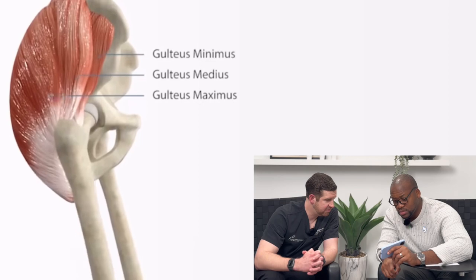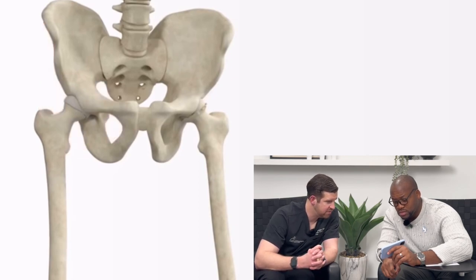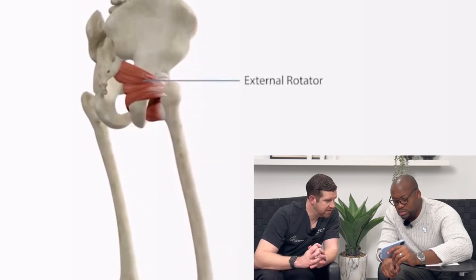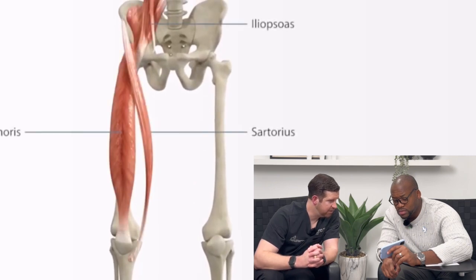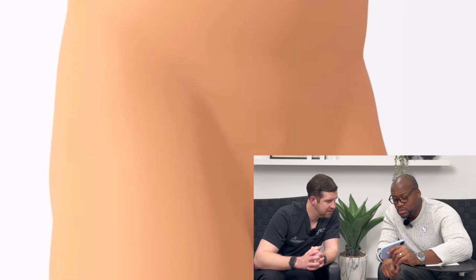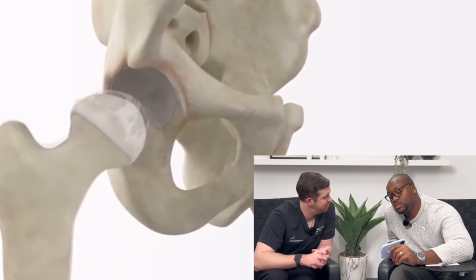You make an incision on the skin — this is showing those muscle planes and how you get to the joint. Even with an anterior approach the incision is on the front but sort of on the side, versus in the back which is what most people are used to. The rotator muscles of the hip, the hamstrings, and the adductor muscles you want to leave intact. Going in from the front, you enter between two layers of muscles and can see the hip. When all said and done you have the new stem, the ball, the socket, and the liner in the socket — and it can actually be pink, believe it or not.